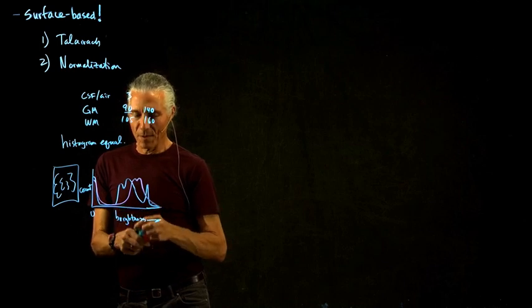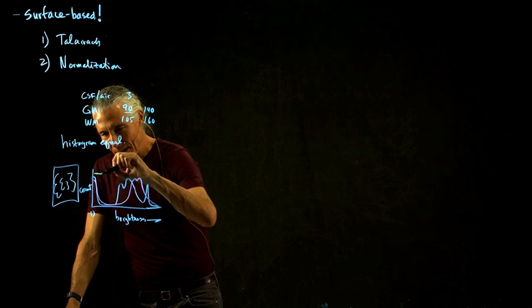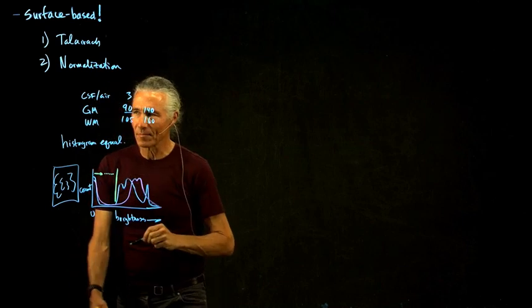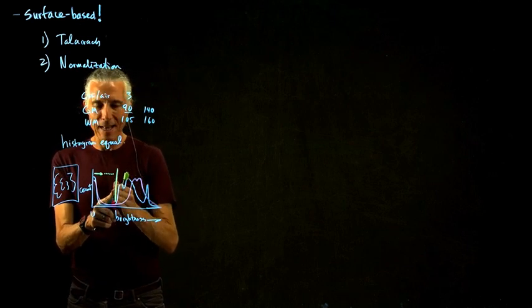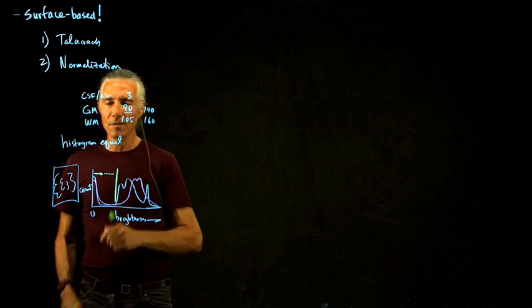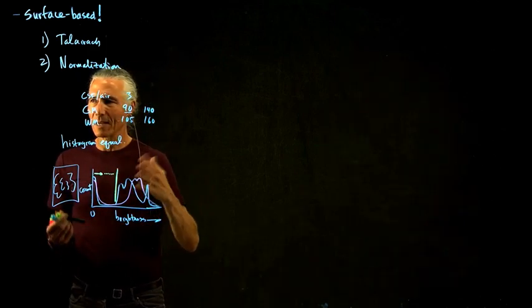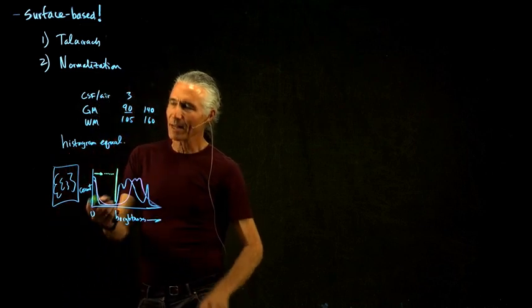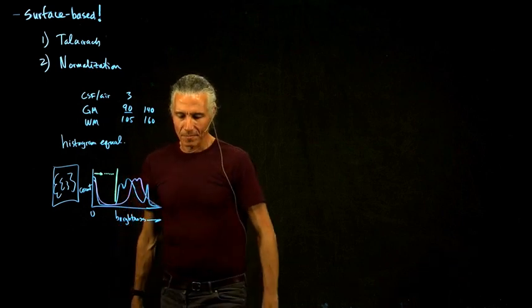One thing we could do is ignore the bottom for a while, and then start searching for where you rise out of the background. And then say, that's what I'm going to multiply everybody by to make that number the same across slices. So that's called histogram equalization. It's a well-known technique in image processing. So that's one way of flattening out the image. There are all different kinds of variations on doing that.